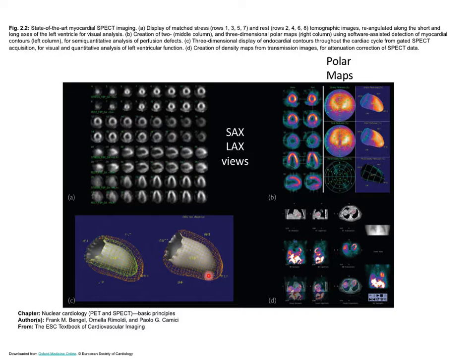A perfusion deficit would be a lower, darker signal painted on that surface. Now to look at the whole heart, you need to be at a computer and rotate that surface around, or have somebody prepare for you, say, a QuickTime movie of that surface being rotated, and then you could just play that back, go back and forth on your phone or whatever, and see if there's a perfusion deficit.